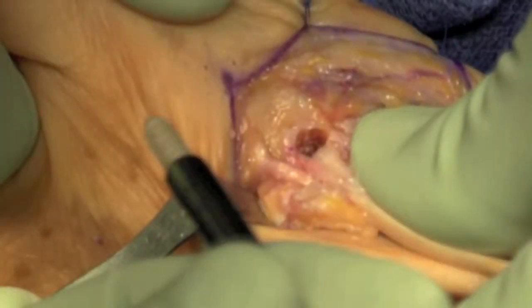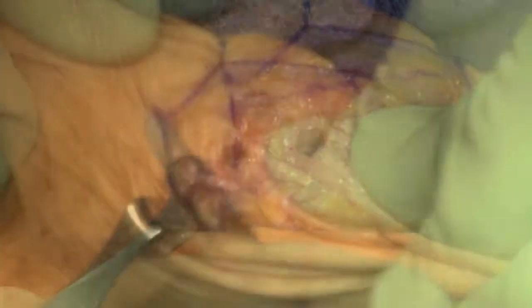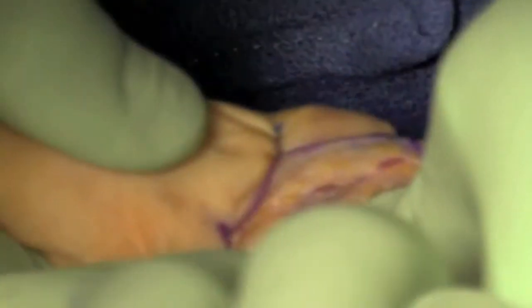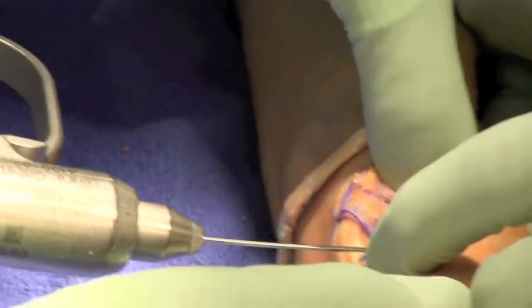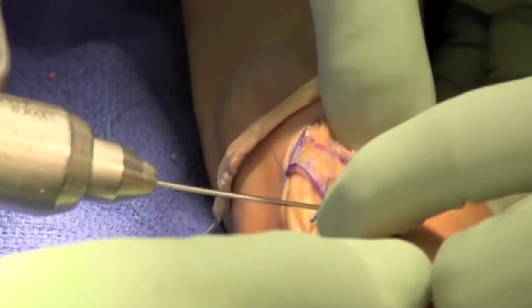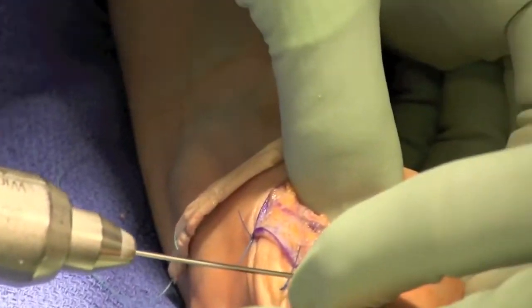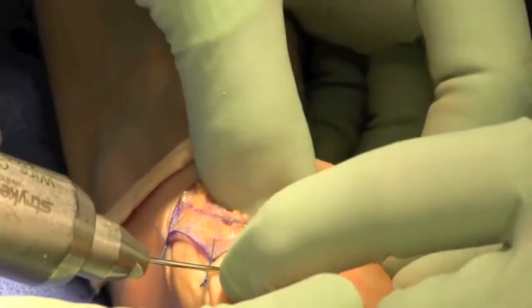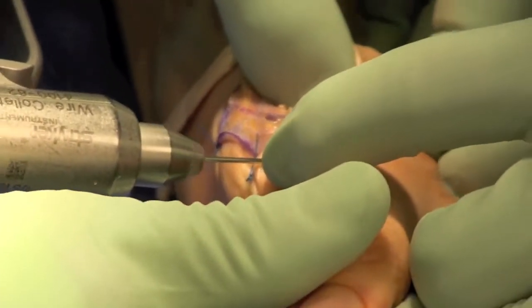The tendon is then fixed using a 4 by 10 millimeter biotenodesis screw. This is done with the thumb in extension, securing the thumb to the second metacarpal. In this case, a temporary retaining K-wire was placed from the first to the second metacarpal.